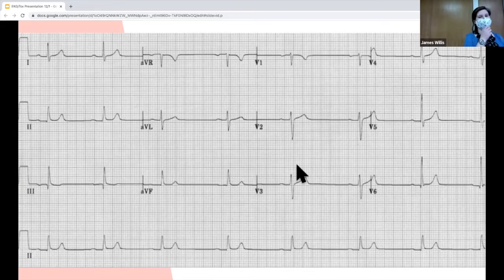Sinus, right? Okay, great. So Shane said sinus bradycardia. Next is our PR interval. It's kind of hard, I'll give you that, to read PR intervals on this screen. Okay, so it's a little long, right? The big boxes are kind of hard to see on here, but it is longer than one big box. So this PR interval is 240 milliseconds.